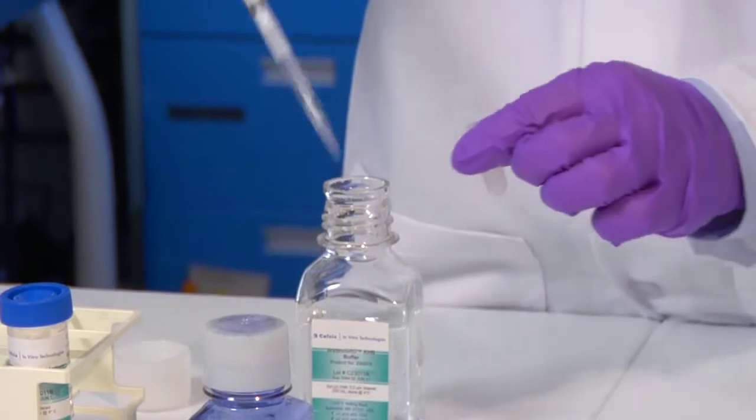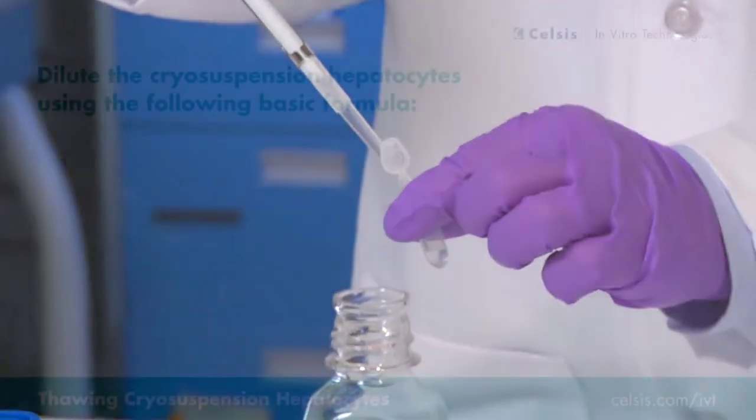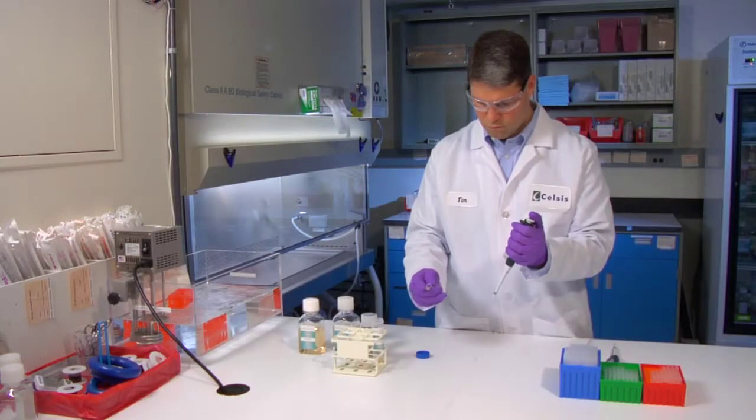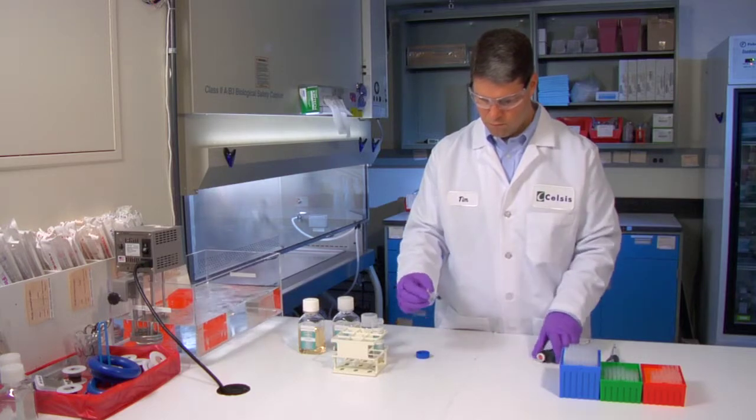Dilute the cryosuspension hepatocytes using the following basic formula: 15 parts of in vitro grow KHB, plus four parts of 0.4% trypan blue solution, plus one part of diluted cells. Be sure to thoroughly mix the suspension prior to taking a sample. An example would be 300 microliters of in vitro grow KHB, 80 microliters of 0.4% trypan blue solution, and 20 microliters of diluted cells in a 1.5 milliliter microcentrifuge tube for a total volume of 400 microliters. Mix and incubate at room temperature for one minute. The cells are now ready to be counted.